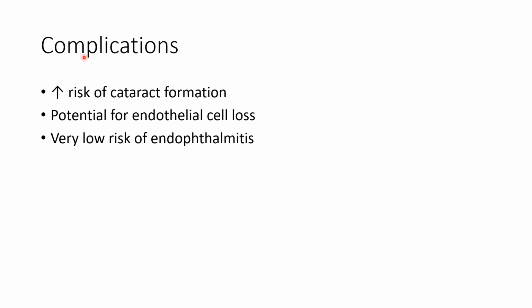Now let us discuss the complications of phakic intraocular lenses. Phakic IOL cases have increased risk of cataract formation. They have a potential for endothelial cell loss and there is a very low risk of endophthalmitis in phakic IOLs.